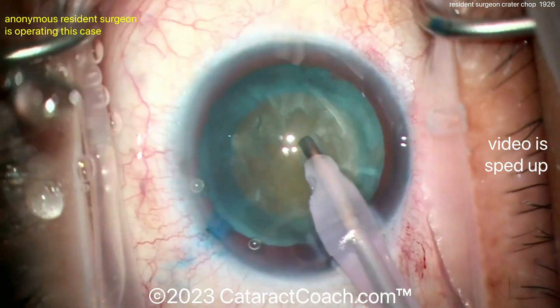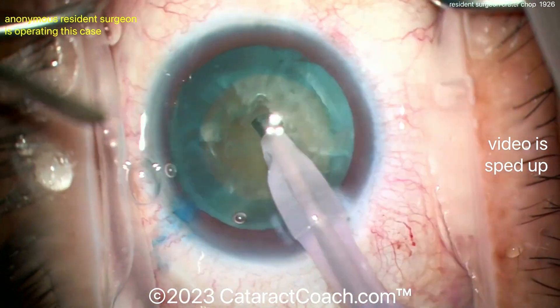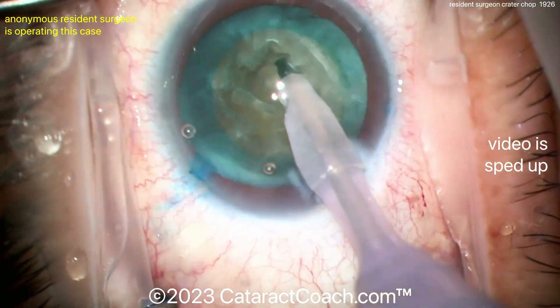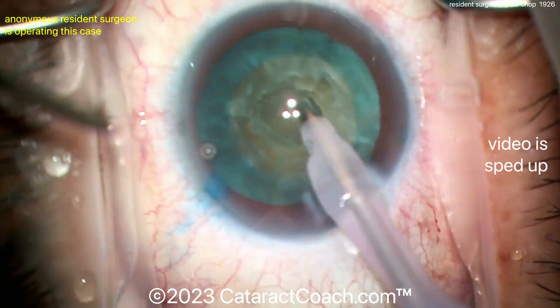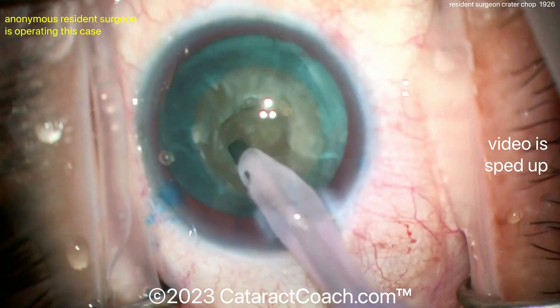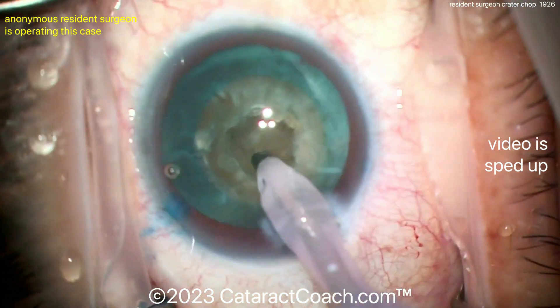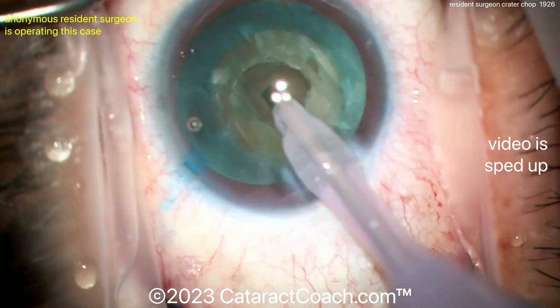Here comes the phaco probe and here comes the crater. The crater means just digging a central pit into the nucleus. Why would you do that? Because you can then put the probe in that pit and do a horizontal chop even without using vacuum to engage the nucleus, because you've trapped the nuclear rim between the phaco probe and the chopper. Obviously don't go too deep, but that's a nice looking central pit.